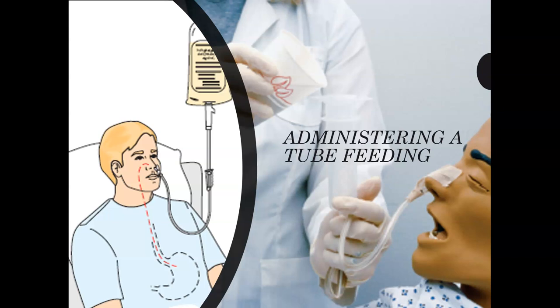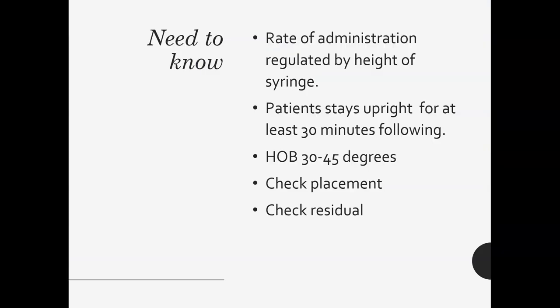Okay. So important things to note is, again, rate of administration, how fast you're giving it, making sure the patient stays upright for at least 30 minutes. Head of bed should be 30 to 45.